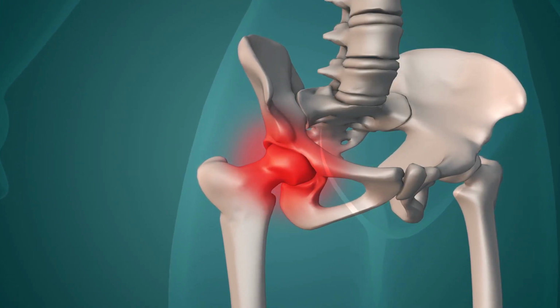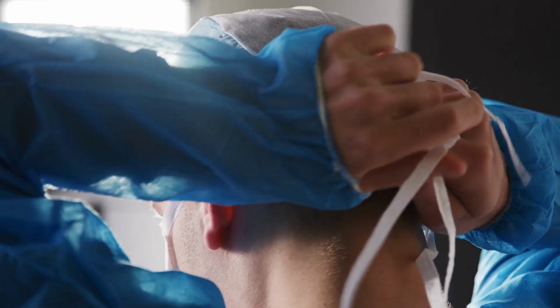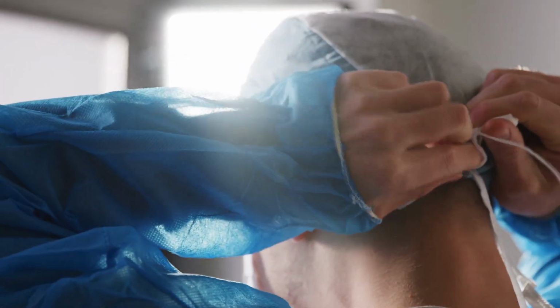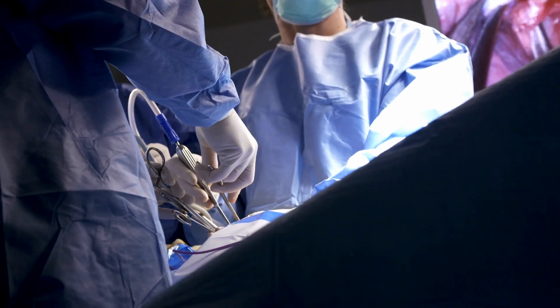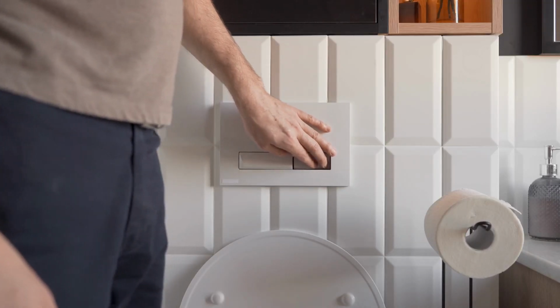Related to the reservoir placement, due to the reservoir being placed most of the time submuscular or in the Retzius space through your inguinal channel, potential de novo inguinal hernia, as well as bladder, bowel, and vascular injury, has been reported, including bowel obstruction and bowel perforation, which would need surgery to resolve.